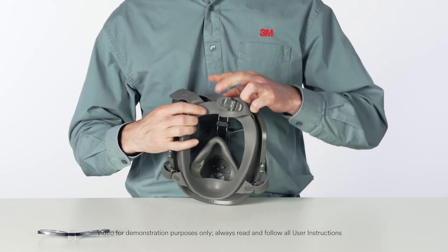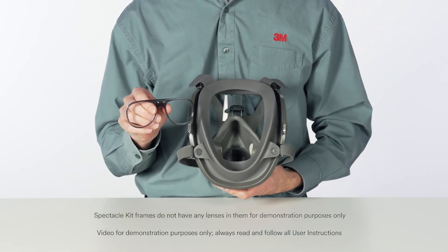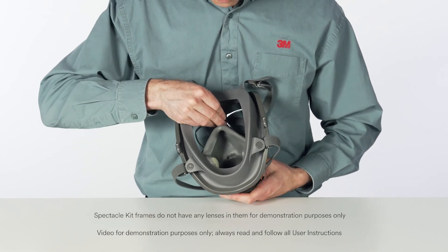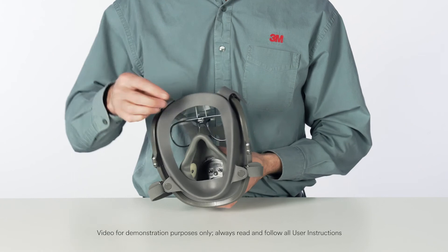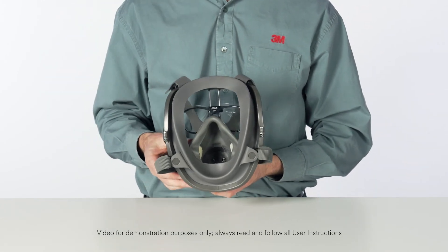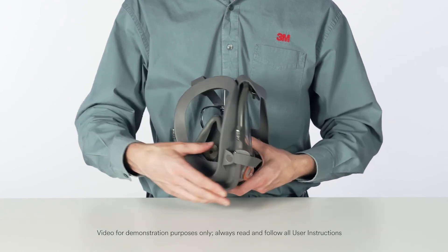Install the frame assembly onto the rail assembly by inserting pins into holes in the rubber slide. The top of the rail is centered between nubs at the top of the face seal. The rubber slide can be removed from the rail assembly and reversed for additional in and out movement of the frame assembly. Spectacles can now be moved up, down, in, or out to obtain optimal fit and vision.